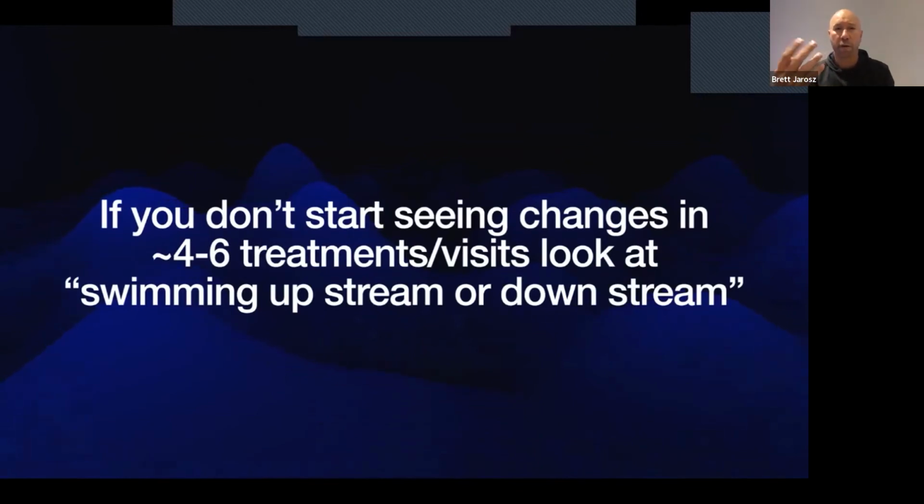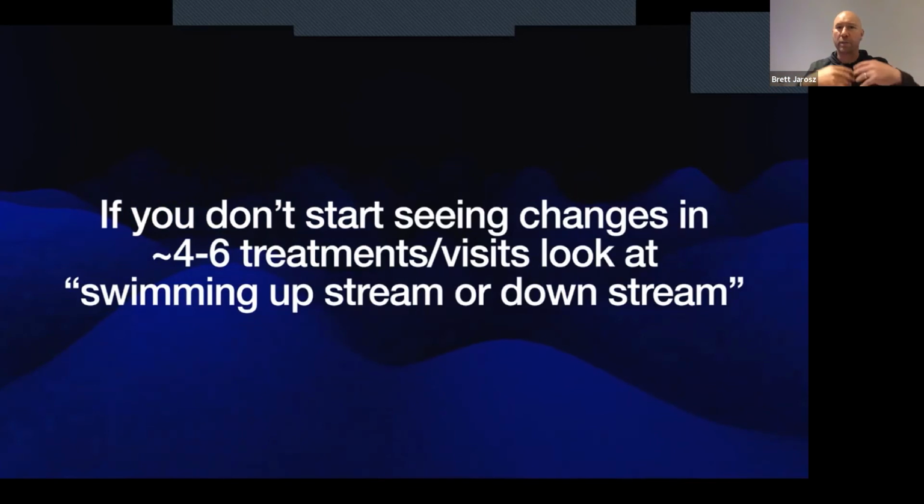So if people are purchasing the EVRL and deciding to add this into your practice base, and again, my bias is that I've started to use this a lot more for a lot of different types of conditions, which we'll share. But if you don't start seeing changes, and when I say that, the patient may report that to you, but also in your objective measures where you're going back and reflecting things, so if you don't start seeing those changes in about 4 to 6, we're not talking people have to be fixed of what they're coming in with, but just seeing that the goals of why you're using that laser or any therapy, we want to see that people are improving.